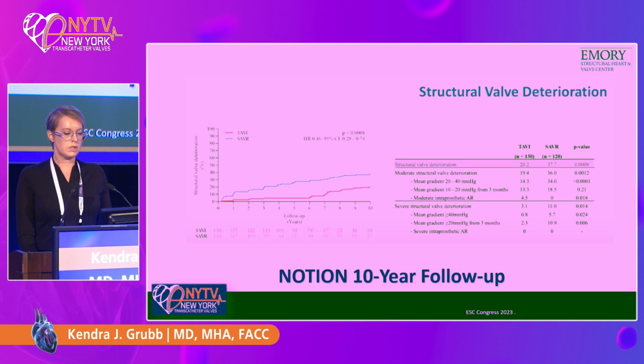And if you look closely, you see at the beginning in that 0 to 1, a lot of this happened in that first year, suggesting the patients were implanted with small valves to begin with, because this definition of structural valve deterioration has to do with gradients on echo. If you put a small valve in to begin with, you cannot overcome that small valve. So as we looked at that CT scan initially, a surgical valve would be pretty small for him. An intra-annular valve may also be small.